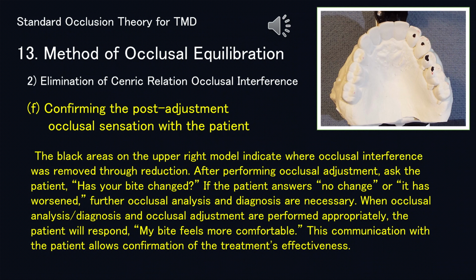When occlusal analysis/diagnosis and occlusal adjustment are performed appropriately, the patient will respond, "My bite feels more comfortable." This communication with the patient allows confirmation of the treatment's effectiveness.